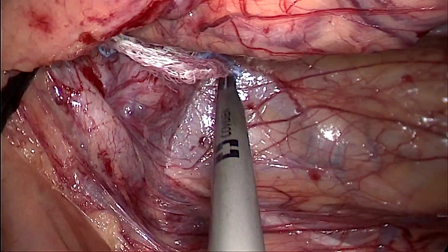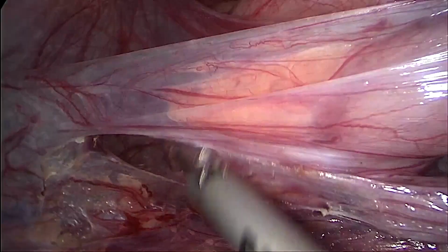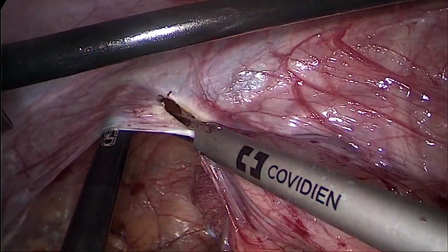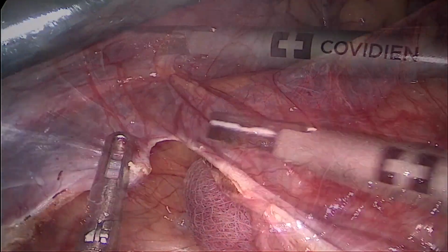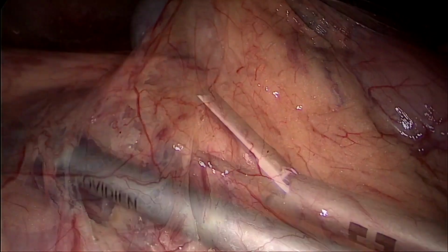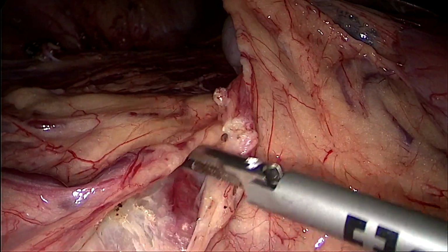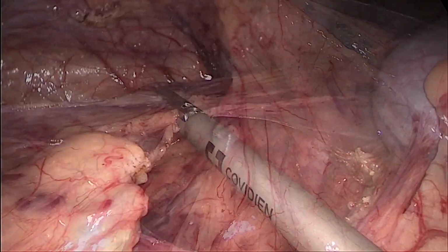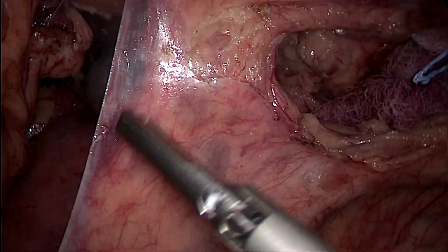So we manage that. We now perform the Toldt fascia dissection on the right side and the right colon dissection. We go through it. This is the epiploon, the greater omentum. So we're resecting it and completing all the right dissection.